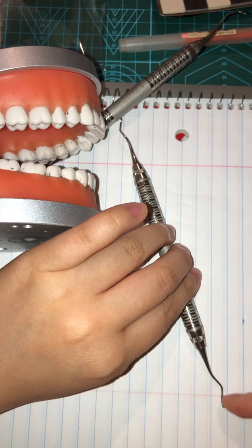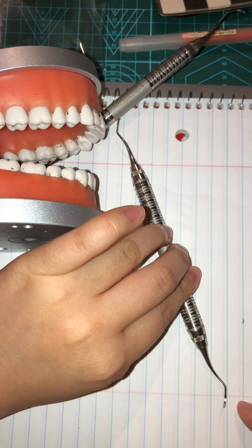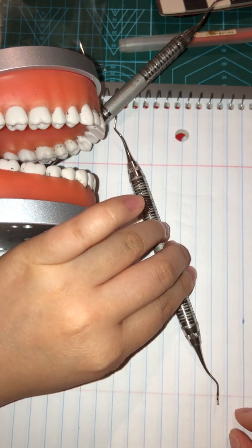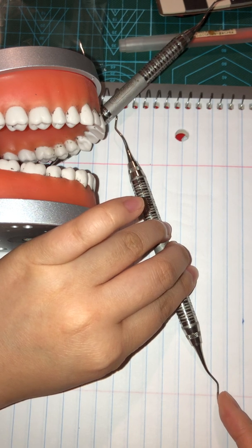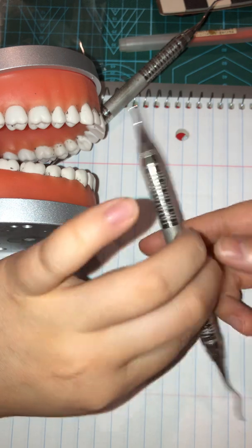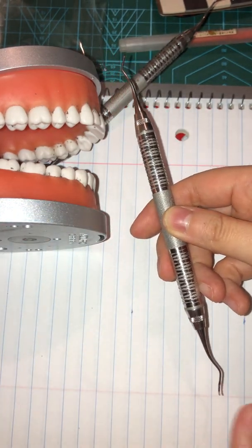Now you actually see that, no, you see it like this. You actually look at it, the light is hitting it like this, so you know that this is actually the lower working edge. So it's here, right?